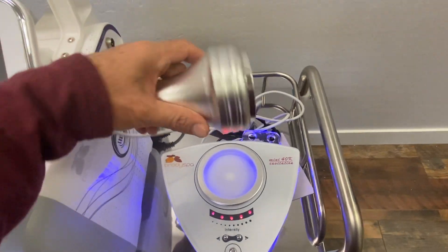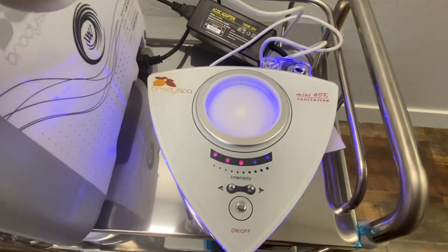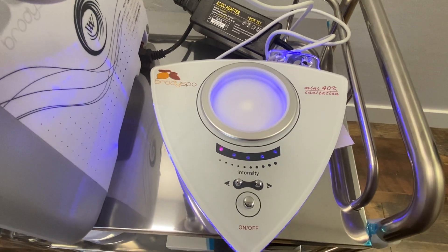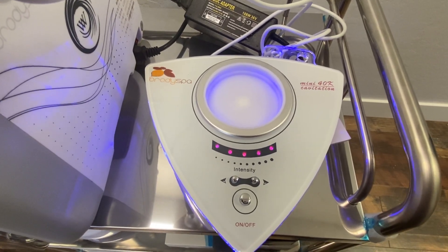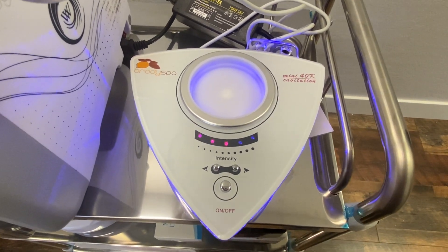You have to make sure you follow that step process, because if not, it will not work. A lot of times you'll see it just beeping or flashing, and that could be due to holding the on button for too long.